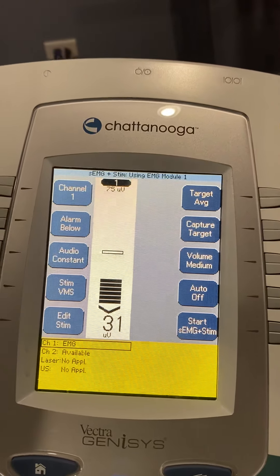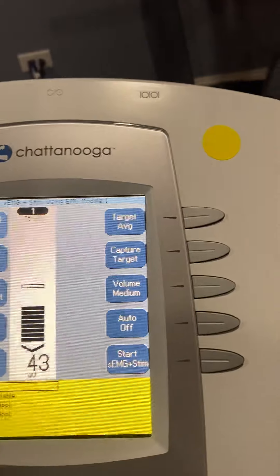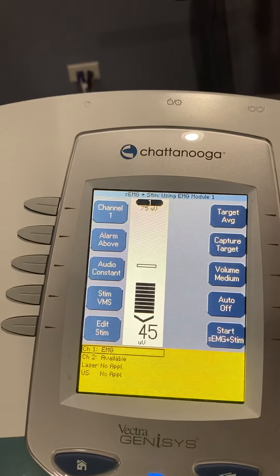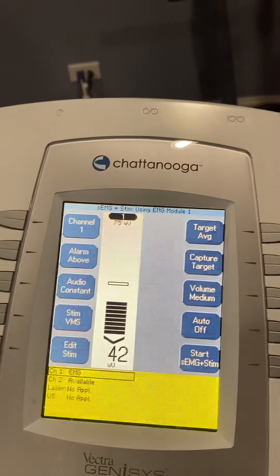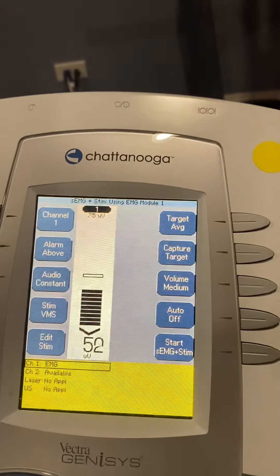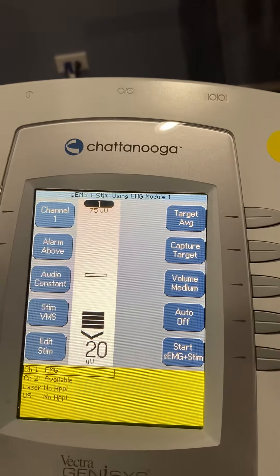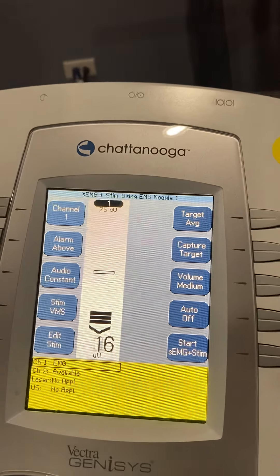Let me rephrase that — she was alarming below, meaning she's being told she's doing good right now. I had this backwards for her. I'd probably want her to alarm above, to tell her 'nope, you're not doing good' — try to relax, think nice thoughts.